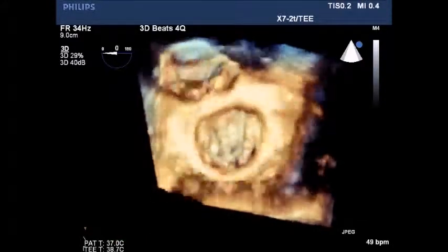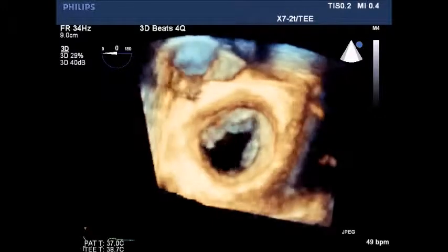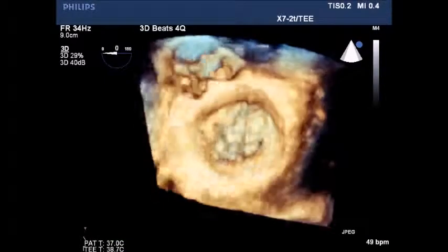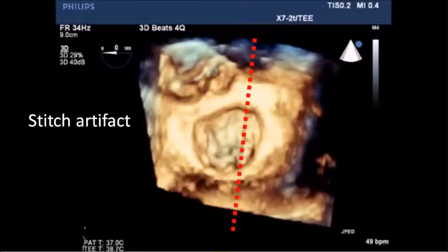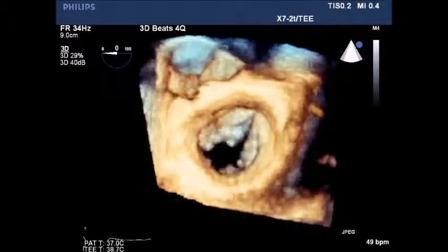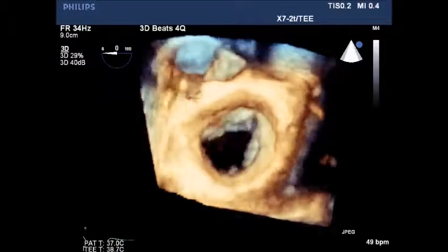At 8 o'clock you can note the entrance of the left atrial appendage. The mitral valve is divided into 1, 2, and 3 regions to facilitate orientation and description. There was also a stitch artifact created while the image was recomposed by the computer.